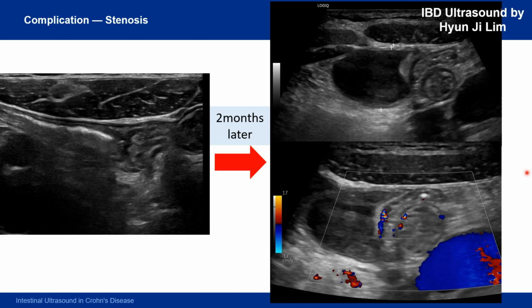However, during a follow-up ultrasound performed 2 months later, we observed exacerbated inflammation in other bowel segments compared to the baseline exam. Also, in this specific lesion, the bowel showed increased edema, prominent mesenteric fat, increased vascularity, and development of upstream fluid distension. This indicates an acute flare-up. It is critical to note that although there was a chronic structural change in the pelvic ileum, it was not initially mainly a stricture or fibrosis. However, when an acute inflammation was superimposed on the pre-existing chronic change, it led to severe passage disturbance.